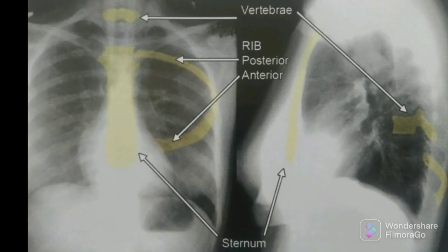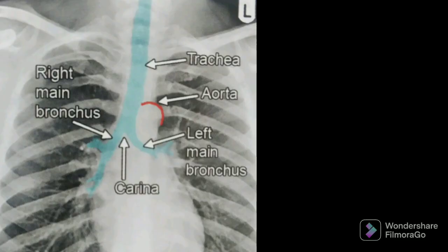Talking about bony structures — highlighted here in yellow — we have the sternum, anterior and posterior ribs, and the vertebral body, which is nicely seen in a lateral view along with the spinous process. Talking about the trachea, we can see the airway going down as a radiolucent shadow, and it can deviate to the left or right in many conditions. We can also visualize the left and right main bronchus along with the carina.